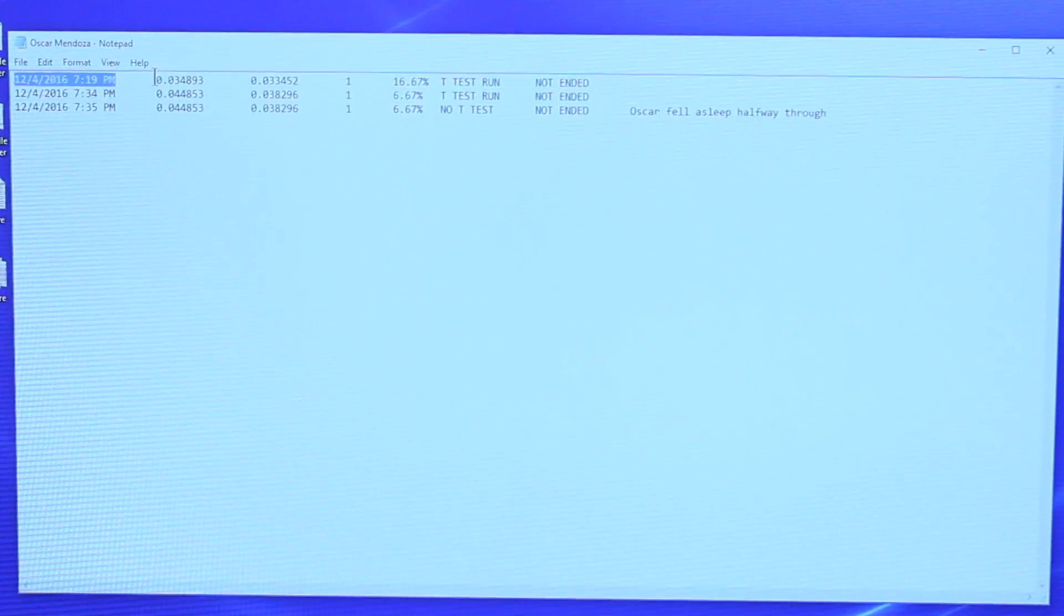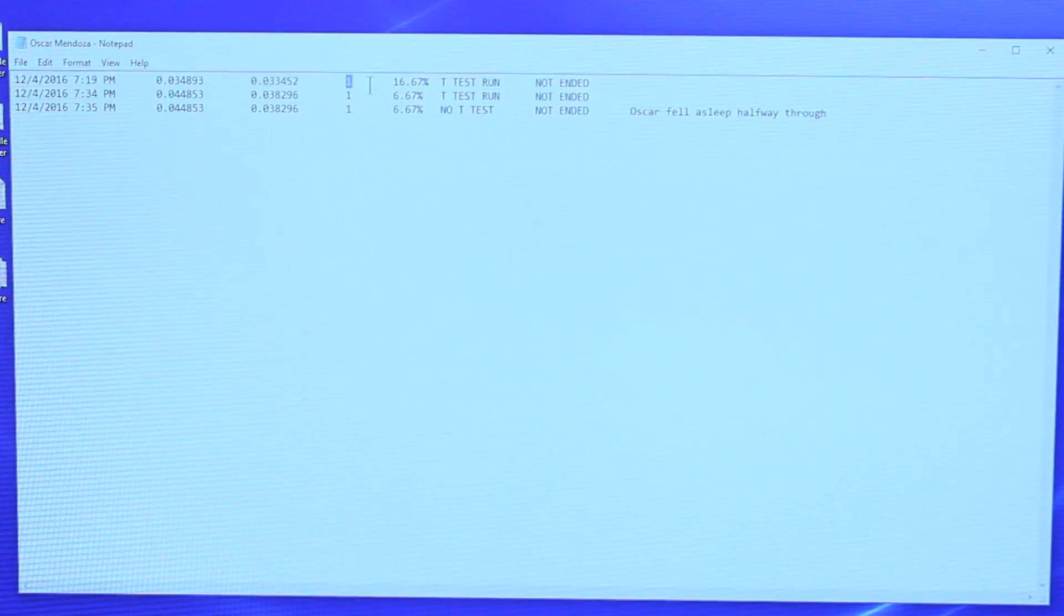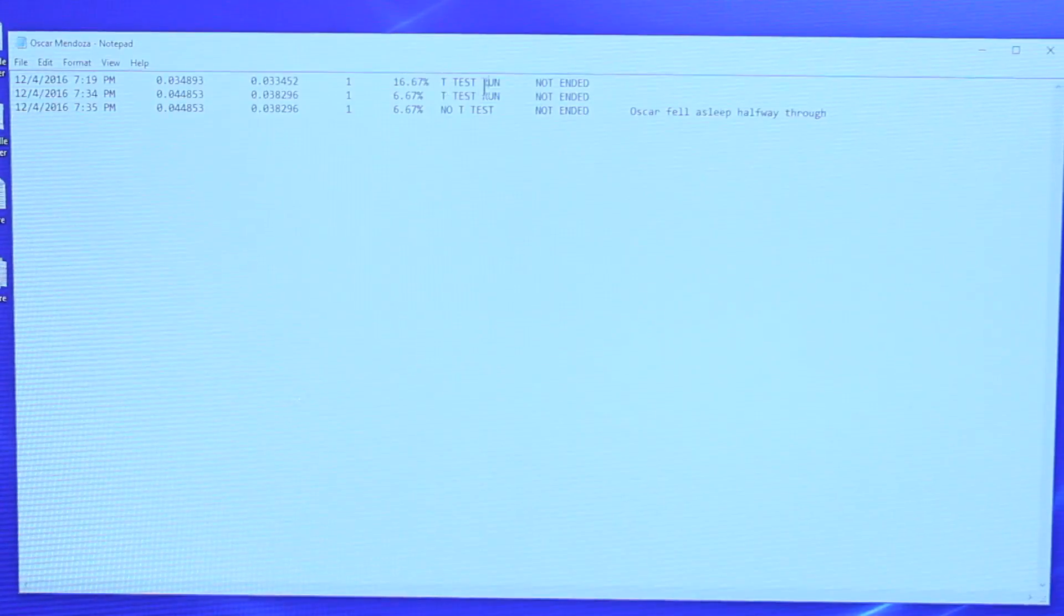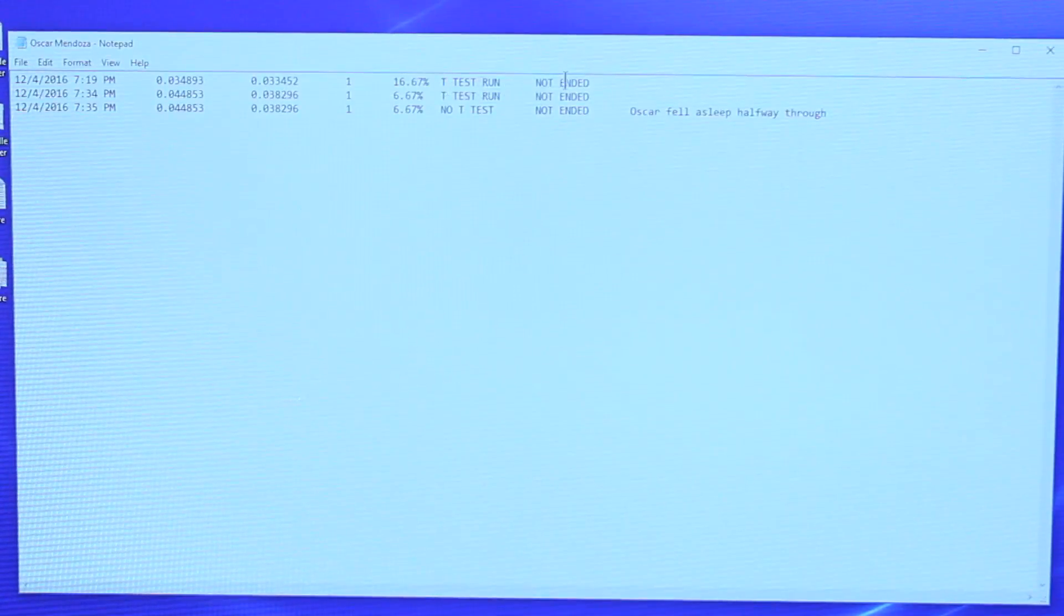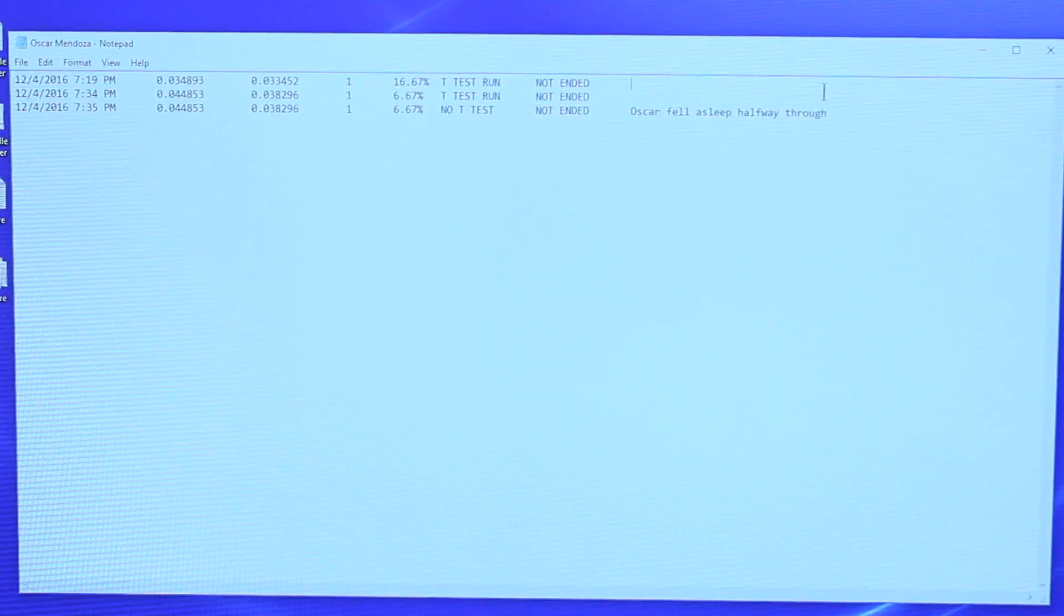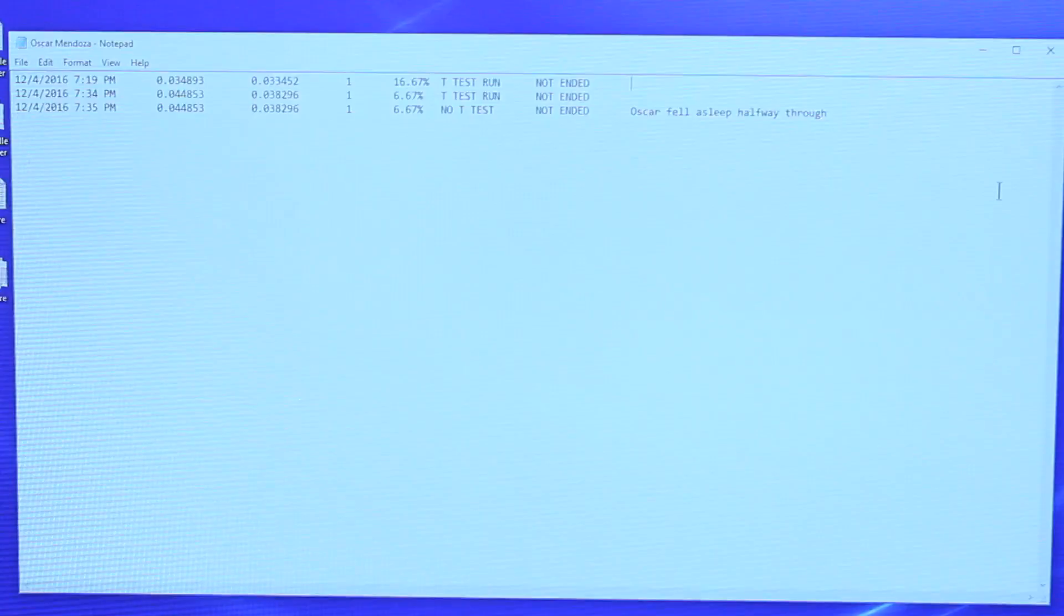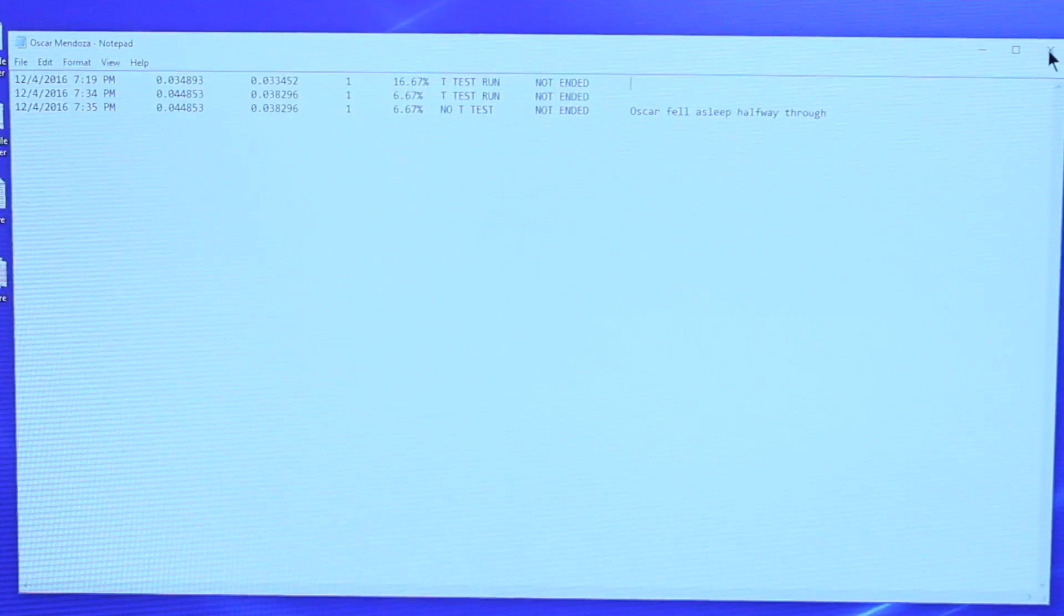As well as the percentage of the time that the muscles were activated in the correct pattern. It also shows whether or not a threshold test was run and whether the button was pressed to end the session prematurely. At the end are any notes from the session.